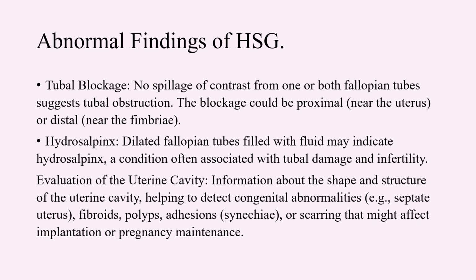In hydrosalpinx, the fallopian tubes are dilated and filled with fluid. This is a condition often associated with tubal damage and infertility.